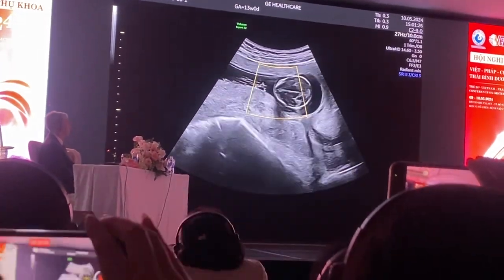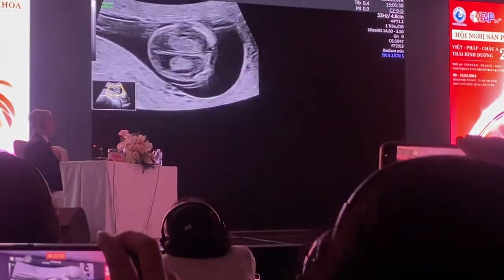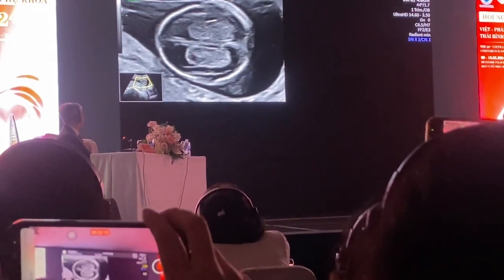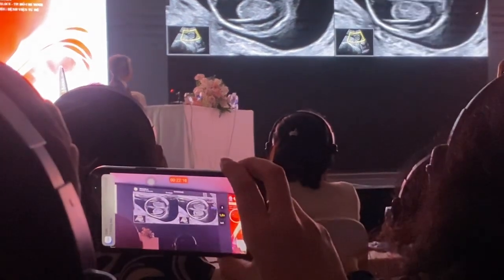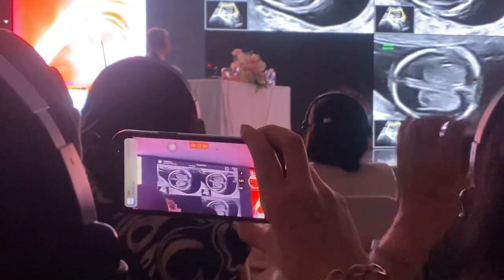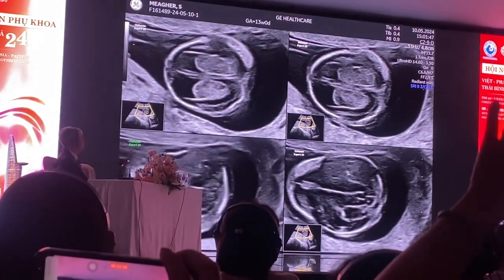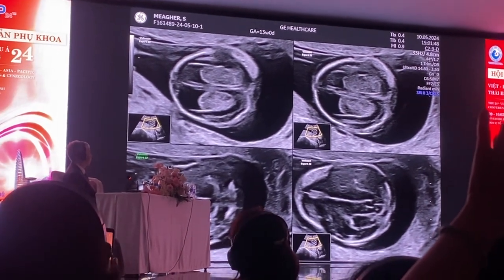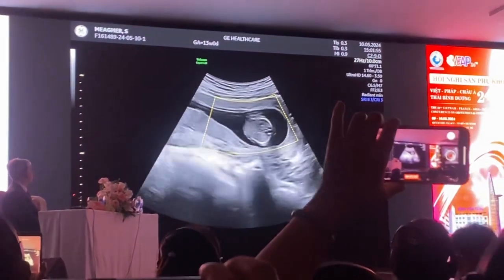The baby, just very quickly, is in a transverse position, and at the very beginning it was not in a transverse position. So very quickly, I just want to go back and show you those 4 segments of the brain. I'm just going to come down to the third, just there, and then come down to the aqueduct of Sylvius. I just want to say this while it's in a transverse position, and then that's the 4th ventricle. So that's the 4-segment analysis. The baby wasn't in a great position at the beginning, but anyway, just to show you that quickly.